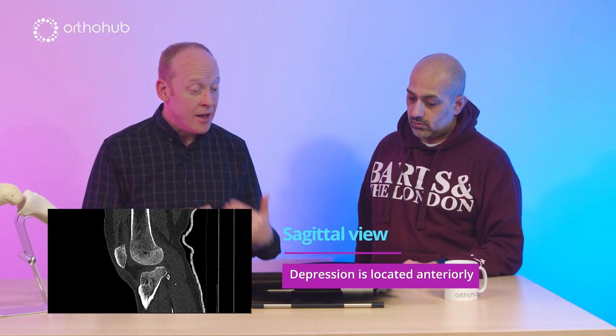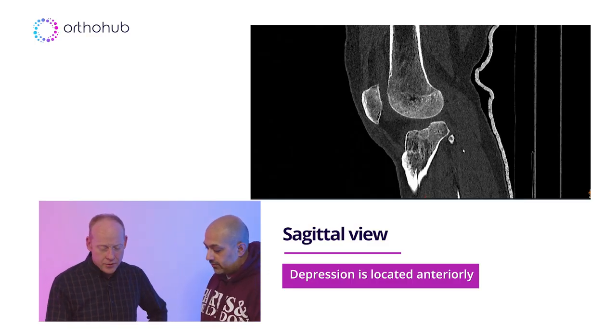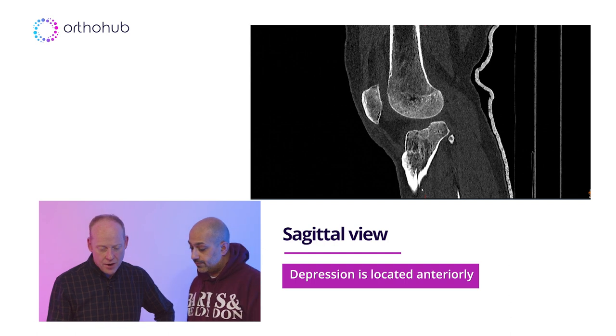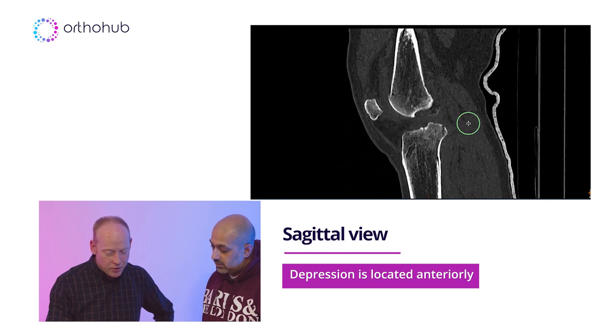So that's where your surgical attention needs to be. And you're getting the hint of a split just there for us. Yeah, you can see the split right down here. Yeah, absolutely. Good. Anything else you want to get from that? No, I can run through a little bit more. A little bit more. But it's an anterior split depression here, isn't it?